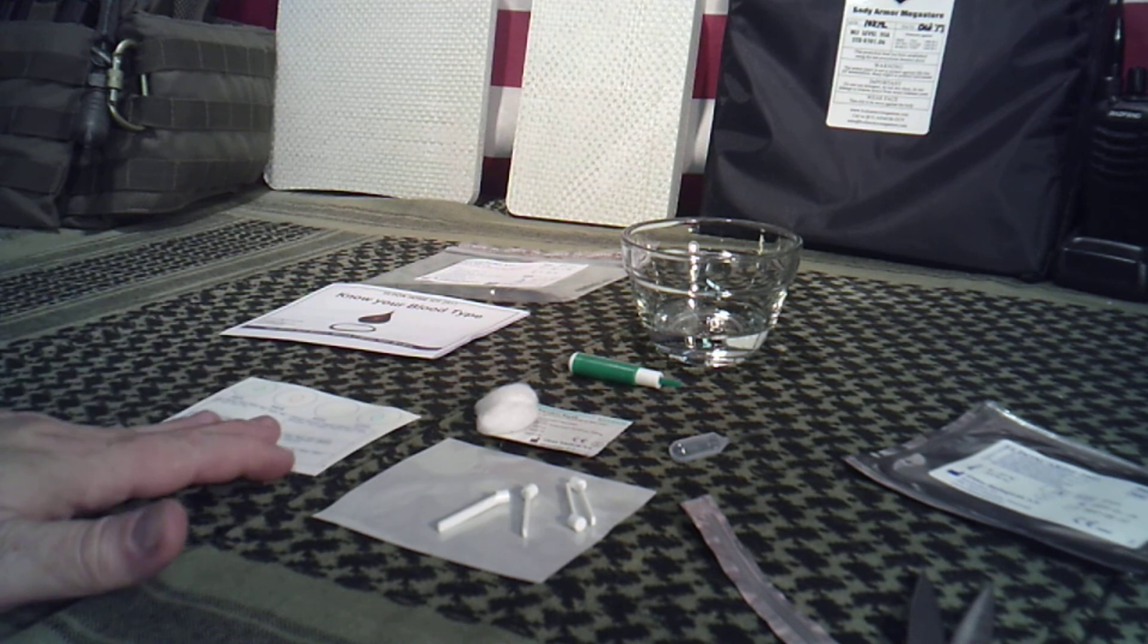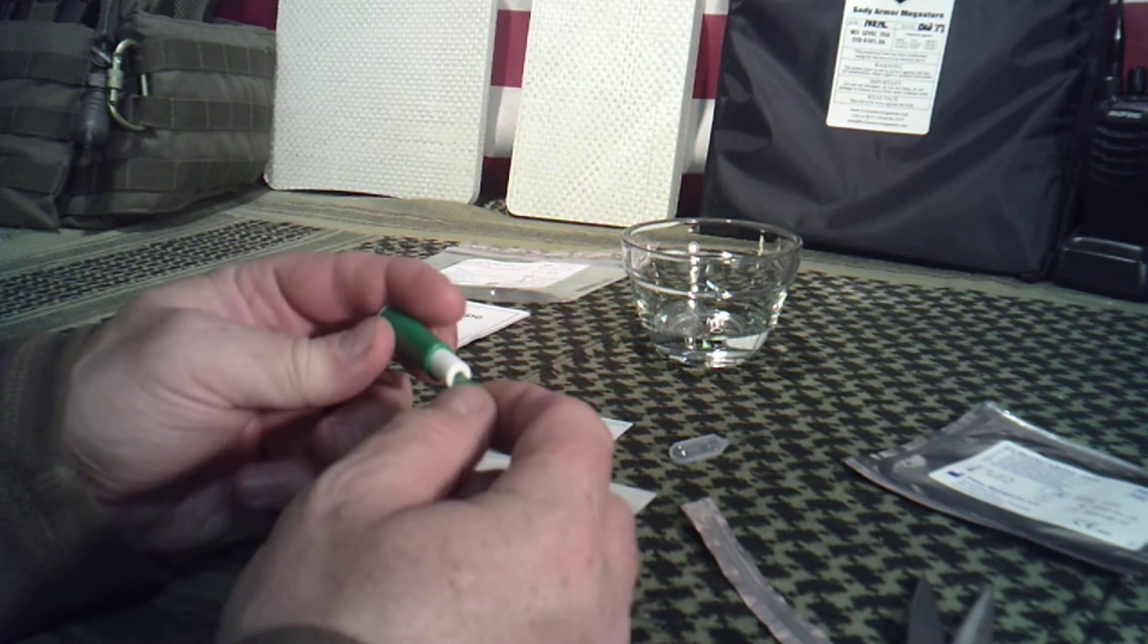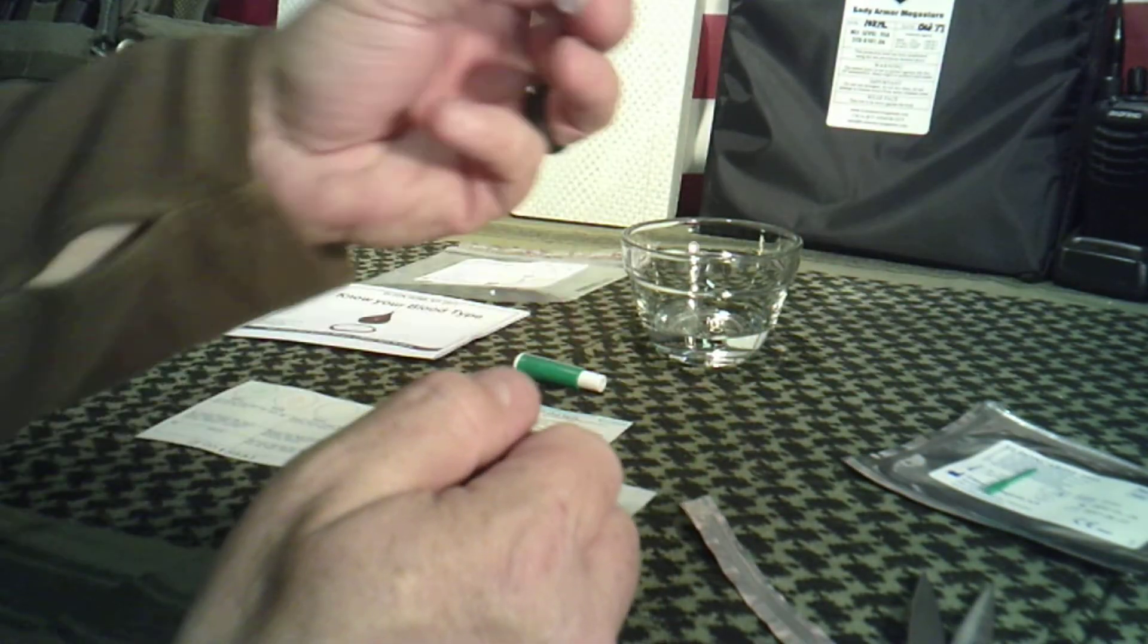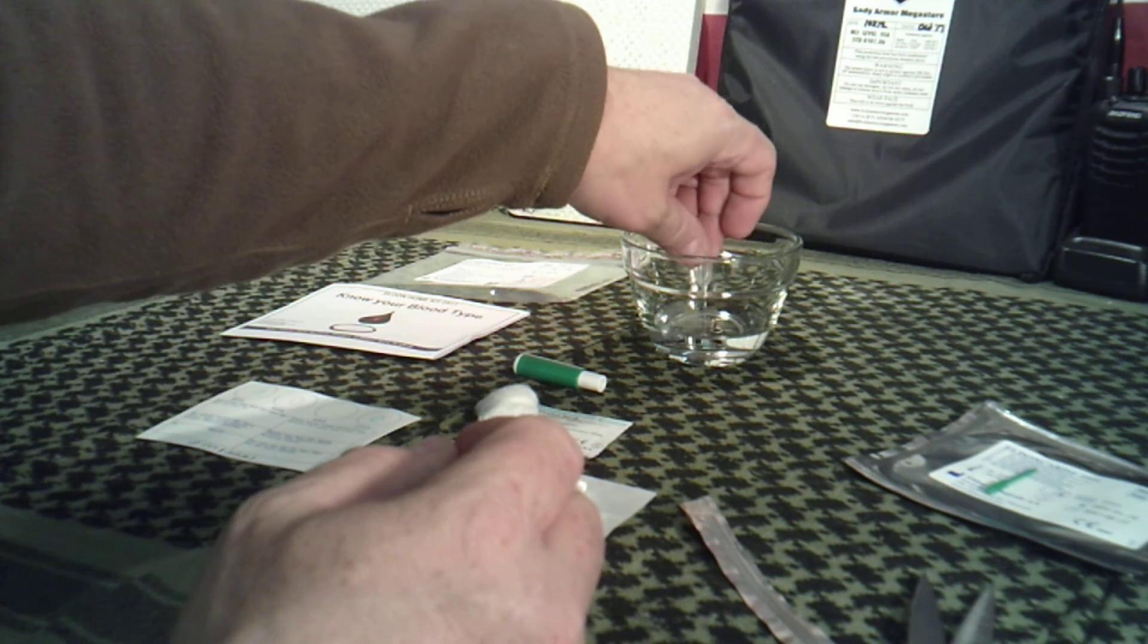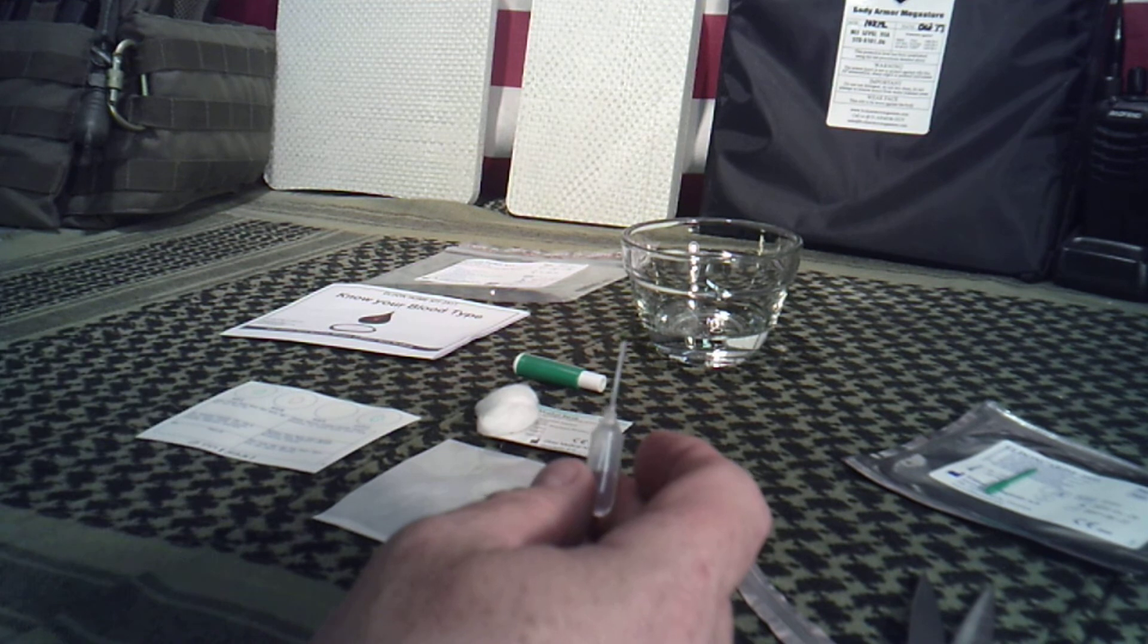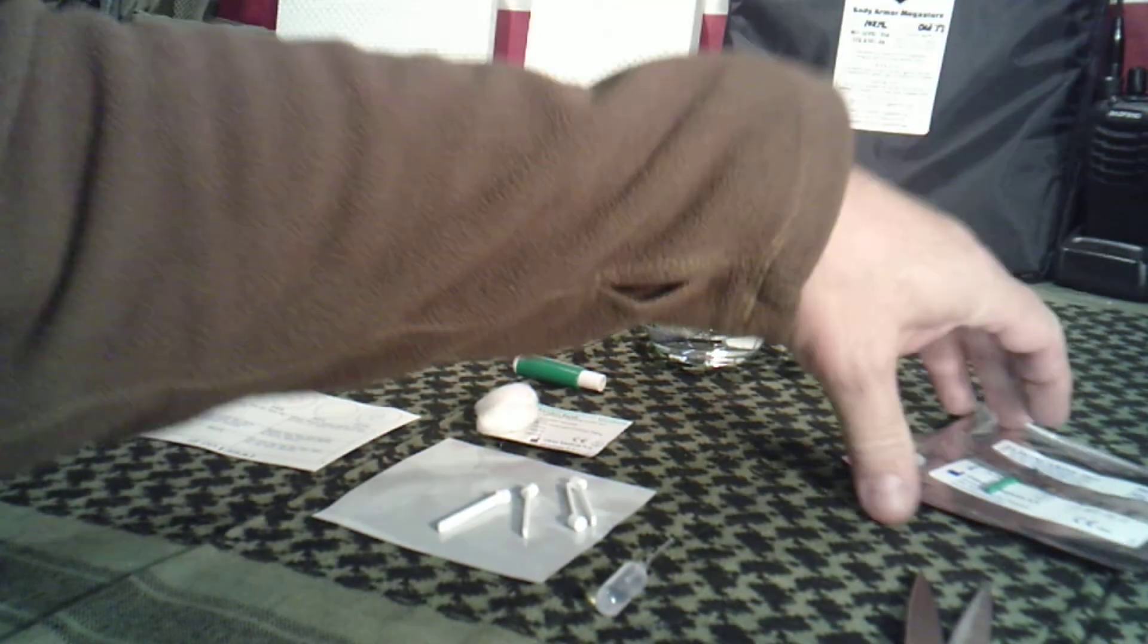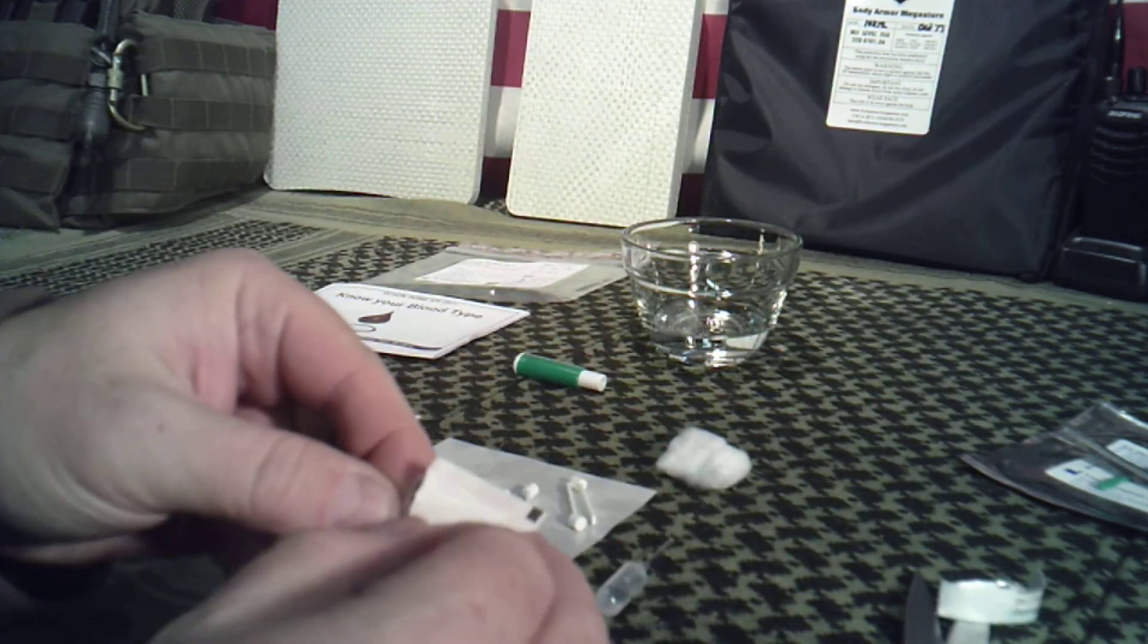What you're going to do is go ahead and get everything prepped and ready. This is the lancet and it has this little safety trigger. Just go ahead and twist and pull that out like that. Then this pipette, go ahead and get distilled water. I don't know if regular tap water would have any negative effects on this, but I use either distilled or some type of filtered water. Then you have your alcohol prep pad, this is to clean your finger before you prick it.